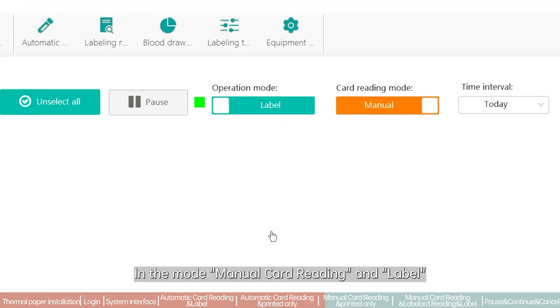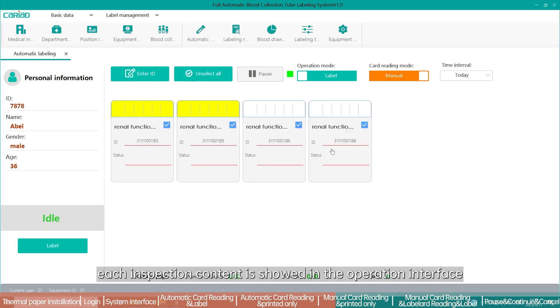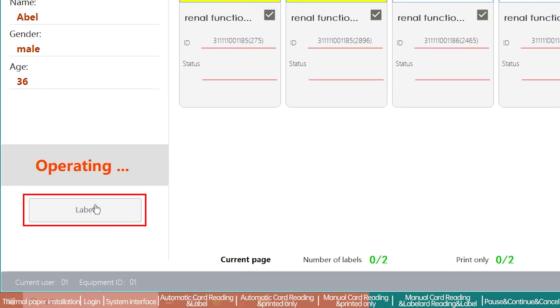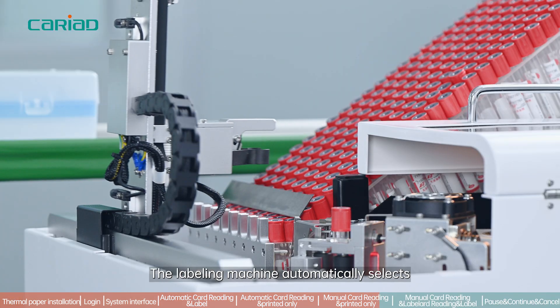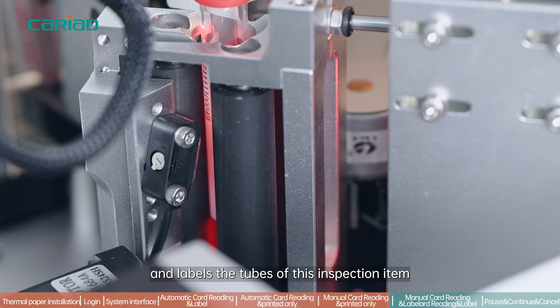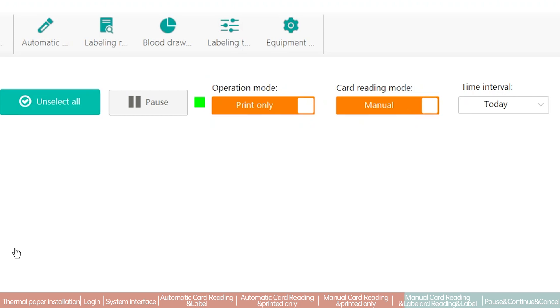In the mode of manual card reading and label, after reading the card or scanning the barcode, each inspection item is shown in the operation interface but the system does not issue any commands automatically. The operator manually double-clicks one or multiple inspection items, then clicks the label button. The system then issues a command to print labels for the selected items, and the labeling machine automatically selects and labels the corresponding tubes.